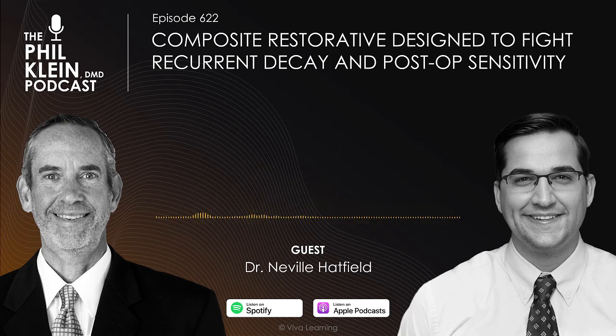Bioactivity is basically taking this concept of, in the past, our materials were very passive in the oral environment, but we're in an inherently dynamic environment with temperature and chewing and pH changes from bacteria. So there's nothing that is passive about our mouth.